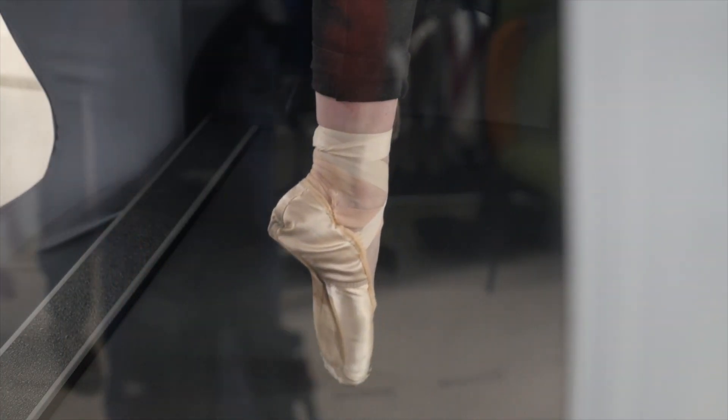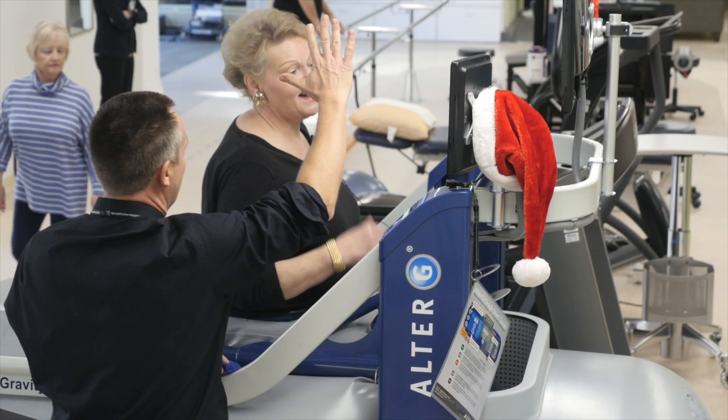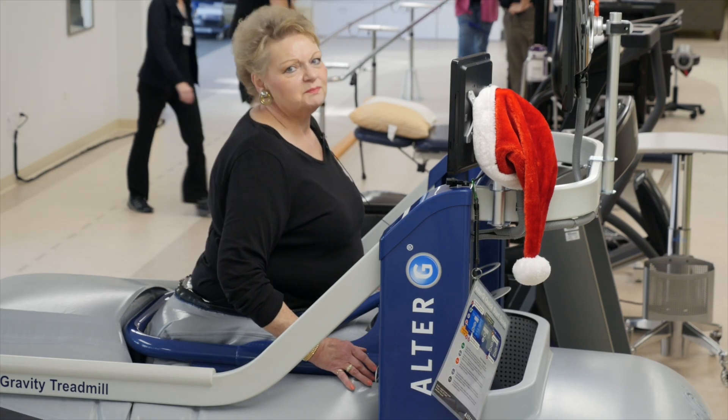We use it mostly with foot and ankle patients, but also with knee and hip patients. And if people are having pain in their spine, it'll de-weight them to a certain extent so they can walk at a more comfortable level. You're in excellent hands when you're here at Mary Free Bed.